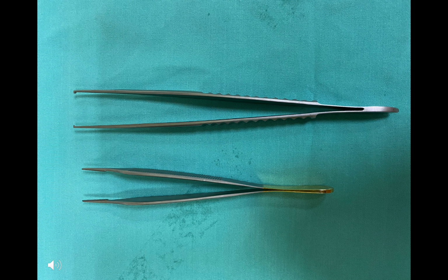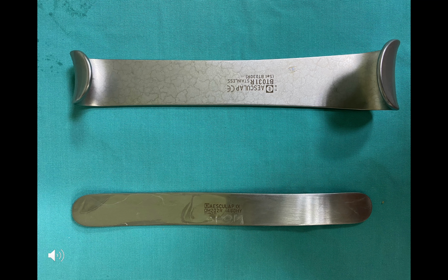So we have non-tooth tissue forceps and a tooth tissue forceps. Please be careful when you are holding the specimen with the tissue forceps, as extra pressure on the specimen will cause crush artifact. And you may use a cheek retractor or tongue depressor if necessary.